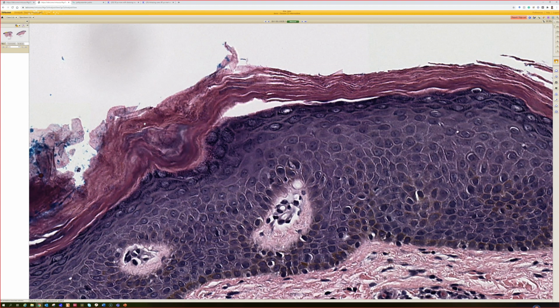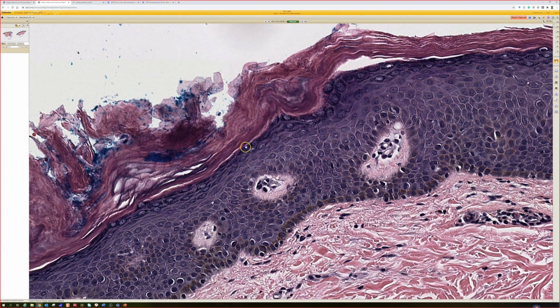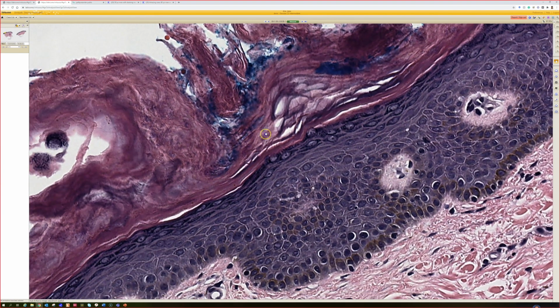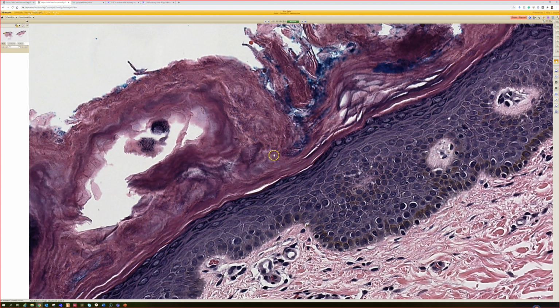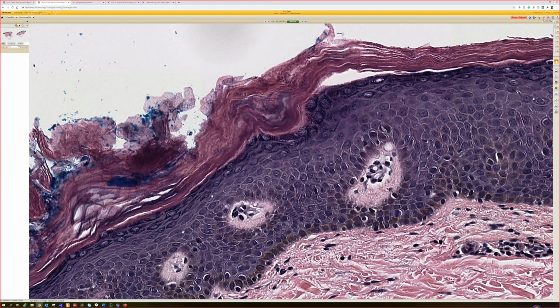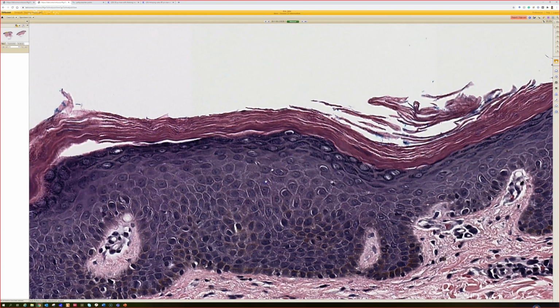And if they're larger, Candida or dermatophyte, but like you said, they are so small here that it kind of led me away from fungal and more into erythrasma. Yeah, so I know that they must be here because this slide is labeled erythrasma, and I do see little blue stuff. But even in the best of situations, on a nice microscope with a good preparation of slide, erythrasma organisms, Corynebacterium minutissimum, are tiny, tiny, tiny little thread-like blue organisms.